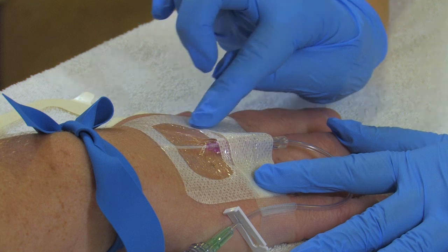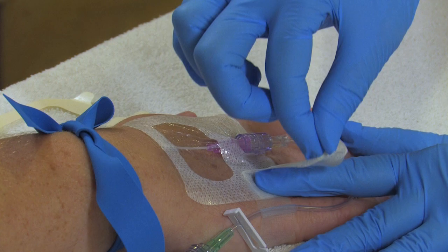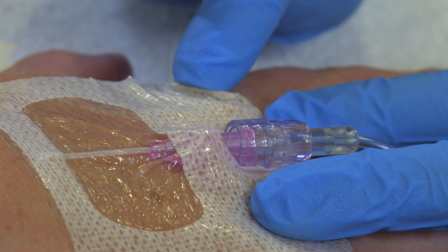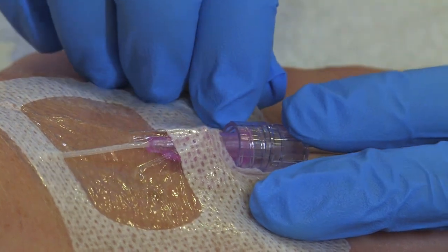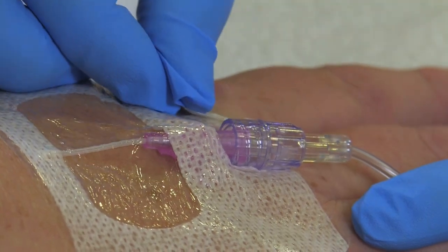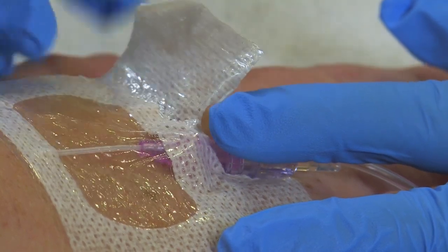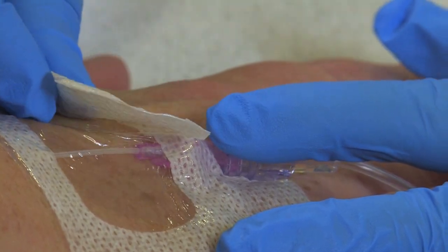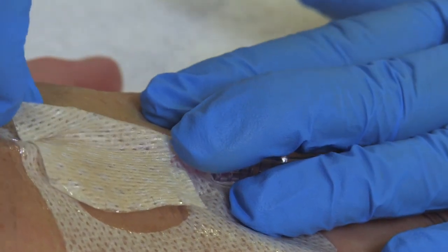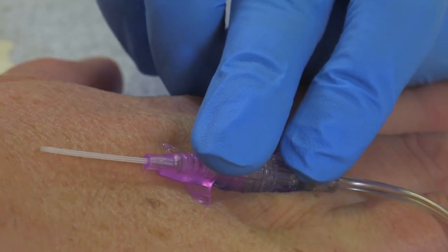And we go to the next piece and we just roll till we catch an edge, and then it very easily peels off. And if you need to change the window, you just roll it back nice and gently till you catch an edge, and then you want to stabilize the catheter. But the important part is to pull it back low and slow so that the 3M device releases itself cleanly from the skin all the way around. And then hold the skin a little taut so that it doesn't pull. Okay. And then you could apply a new bandage.